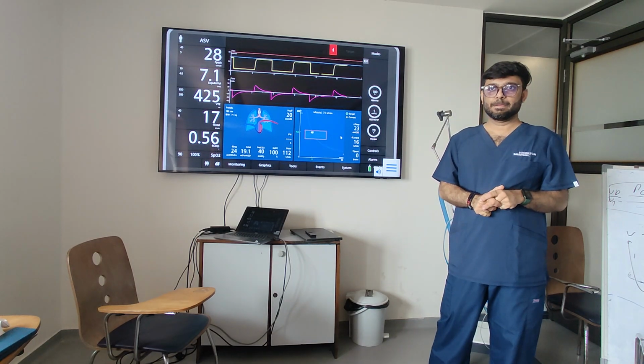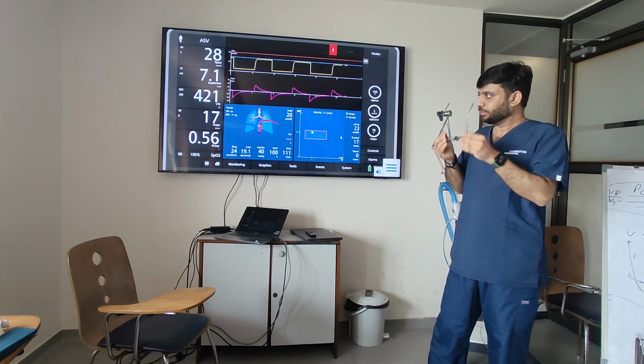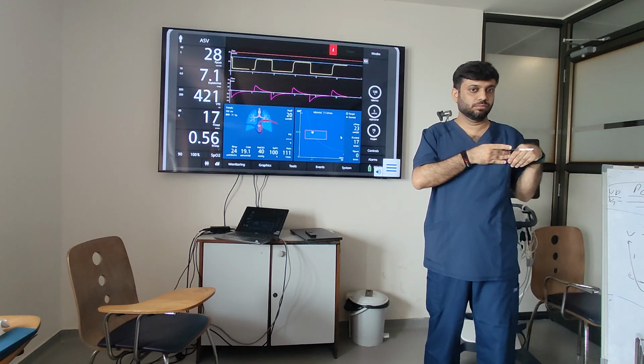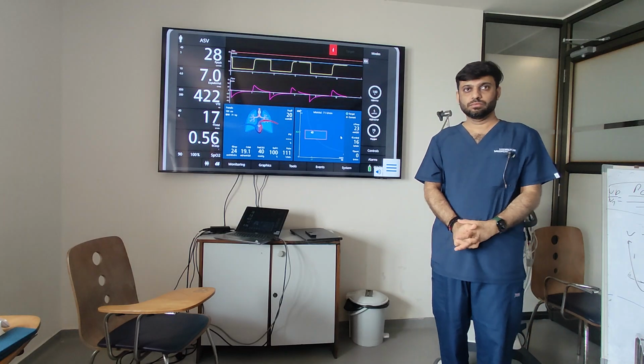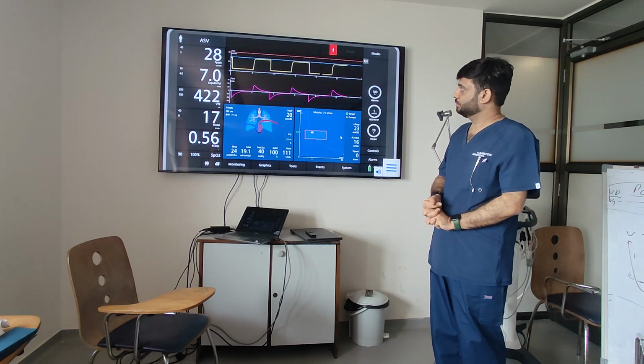It's got both. So basically, you have to look at the context. You cannot just look at one number. That's exactly what we're trying to tell you. Look at the context of what's happening. This ventilator will give you that context by giving you all sides of the story.